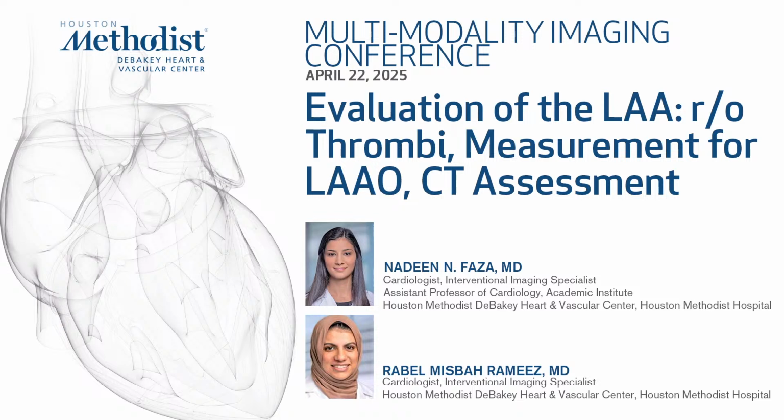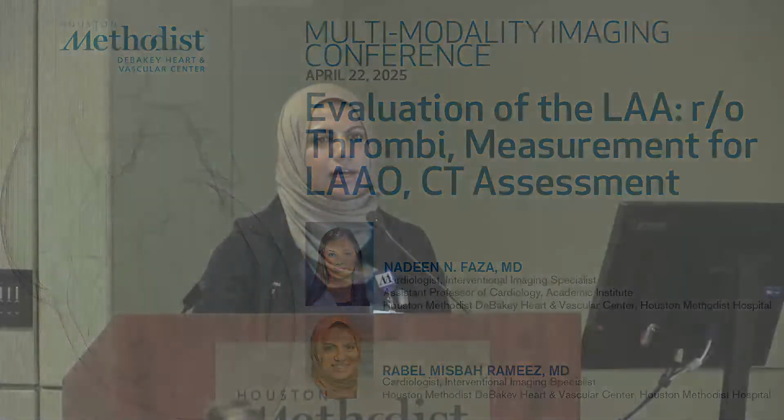Thanks, Dr. Faza, for that amazing talk, looking at the role of TEE in evaluating the left atrial appendage. And this talk is going to be complementary, just highlighting all the modalities we have available and the complementary role of TEE, CT, and ICE imaging in this space.